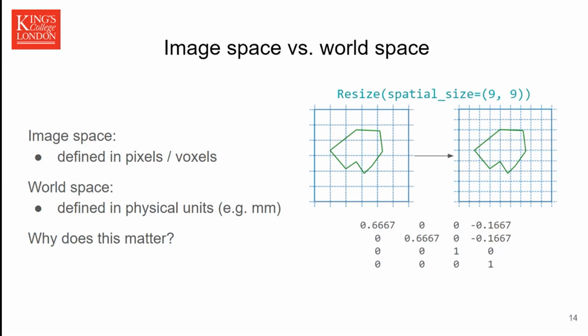So as a result, if you wish to use transforms like resize, along with the pure spatial transforms, you should ensure that your geometric data is defined in terms of pixels or voxels. Now, there currently isn't MONAI support for this in this early release of the geometric resampling, but it's actually quite an easy thing to do. You can look up the pixel dims in your data, and you can use those to basically multiply your point coordinates. Although obviously we will support this with first class support in MONAI through various transform helpers.